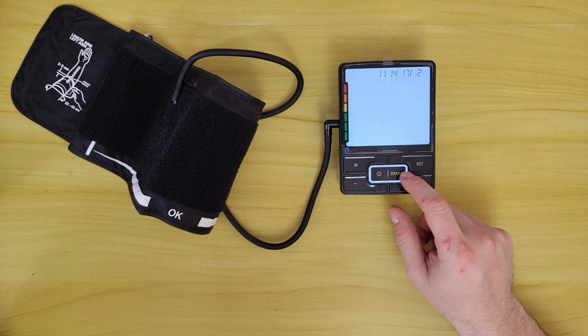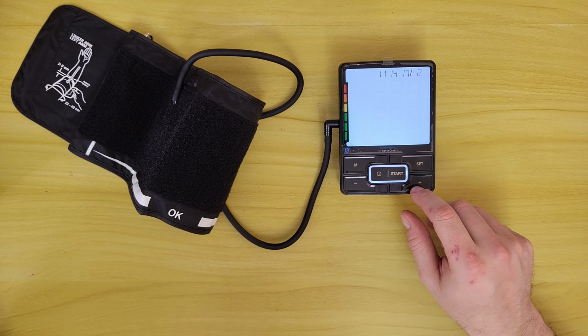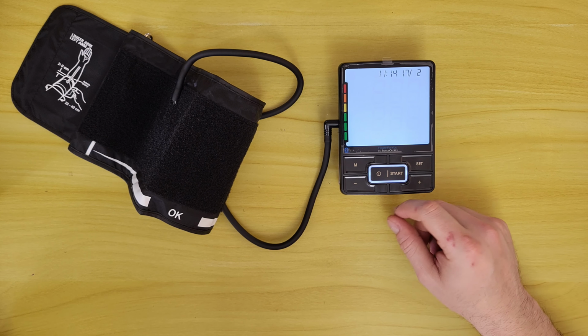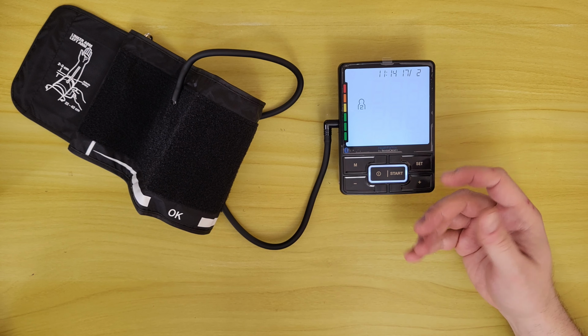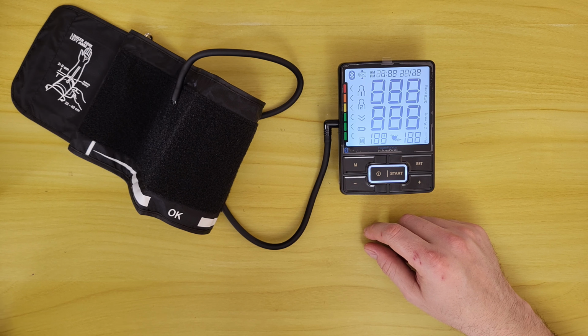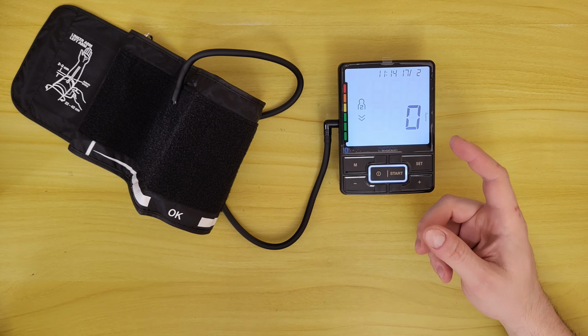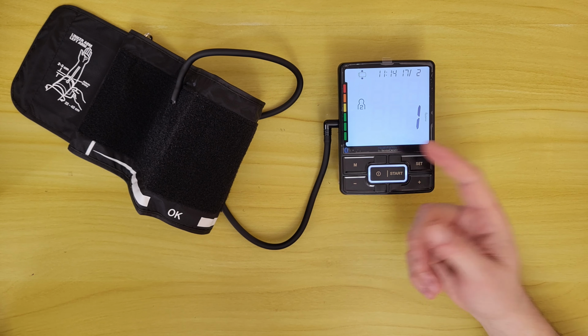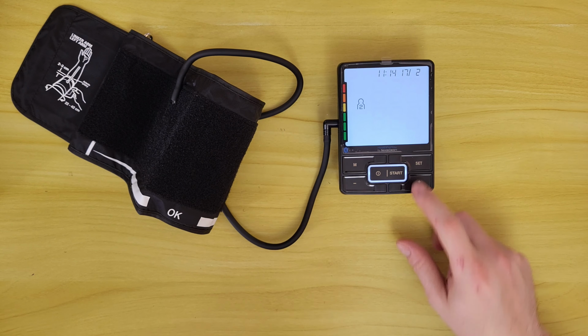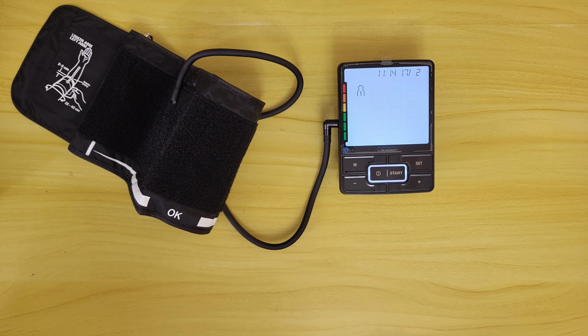Starting again by pressing the start button, and with the decrease/increase button, you can choose the second person or the first person, and start the measurement. And by just pressing the start button again, it will start the measurement for the second person and stop. Press again, it goes to the first person.